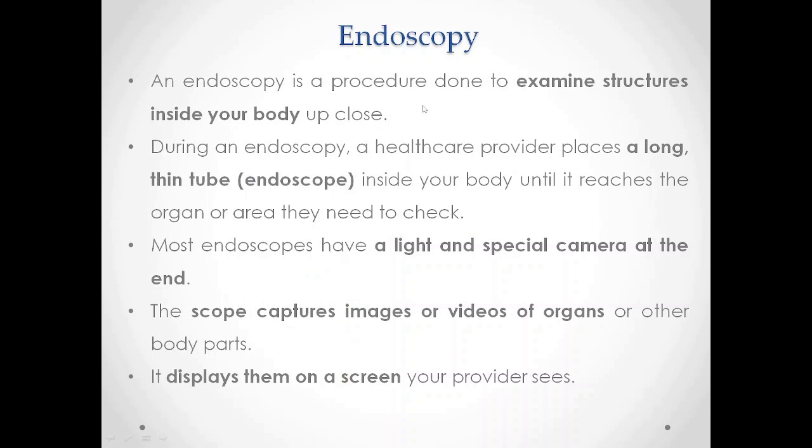Endoscopy is a procedure which is done to examine structures that are inside your body. During the procedure, the healthcare provider or the person who does the endoscopy will place a long thin tube inside your body until it reaches the particular organ which they have to check. It may be your stomach, it may be your intestine or whatever it is.